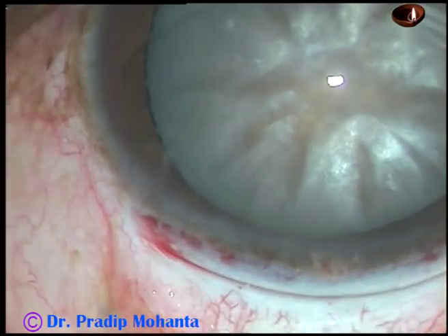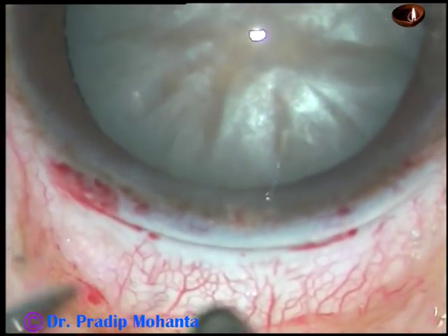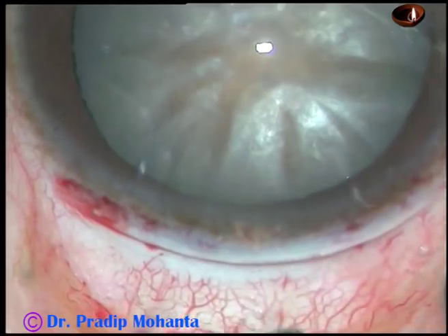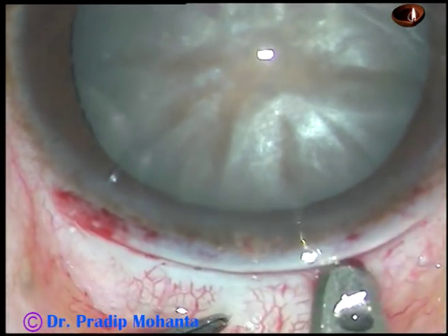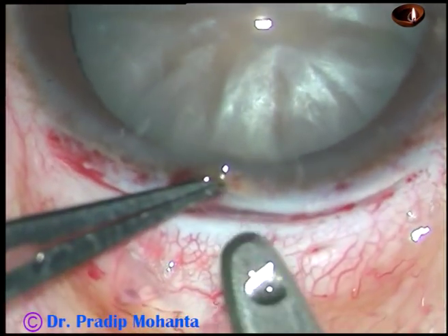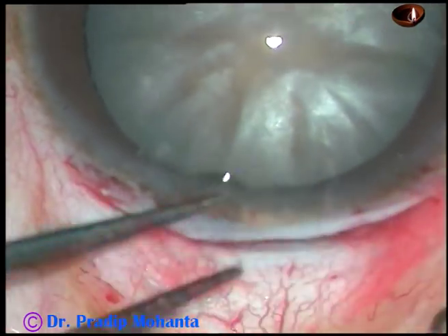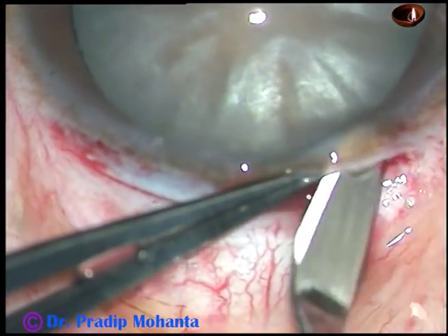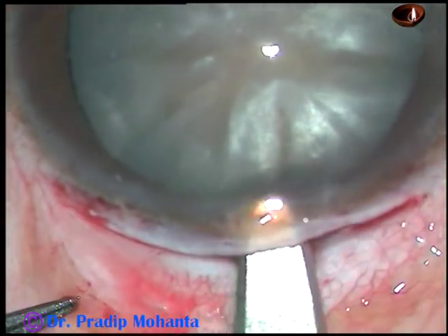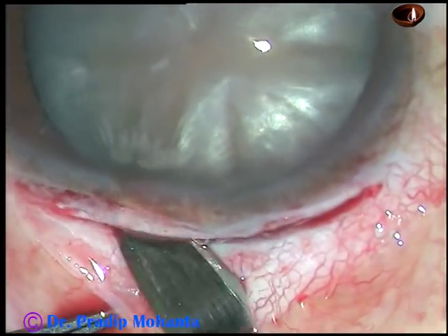The plan is to make a very small tunnel up to 1 mm into clear cornea. A crescent blade is used to make the tunnel. It should be a very nice dissection along one plane — we should not change the plane. This is very easy for beginners. You don't have to make a very large tunnel, just a small tunnel, 1 mm behind and 1 mm in front of the limbus.